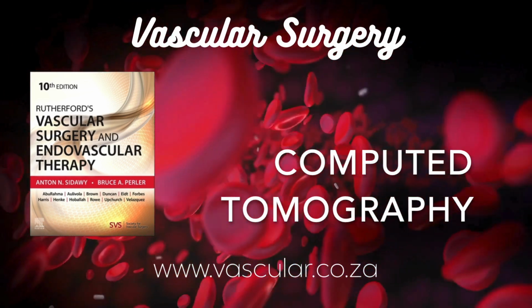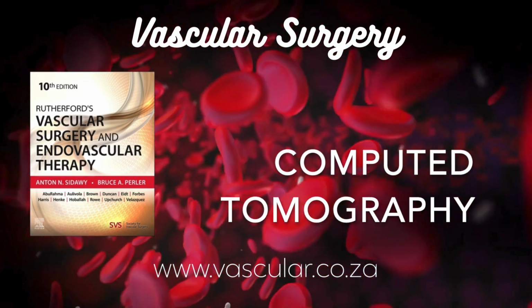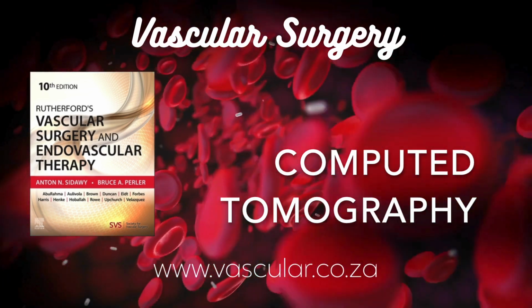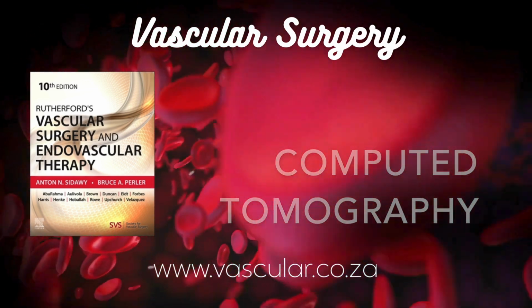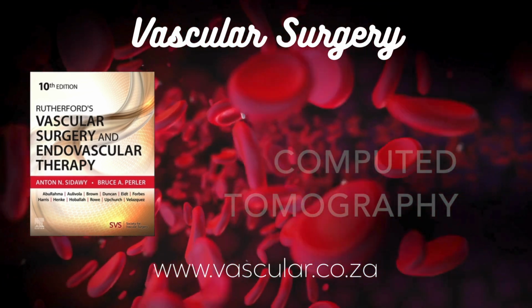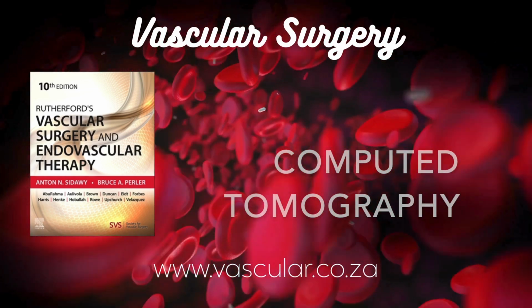MRA versus CTA. Head to head. For aortic endograft planning, CTA often wins due to better calcium visualization. For heavily calcified tibial arteries, MRA might edge it out as calcium doesn't obscure the lumen. Overall, CTA is generally faster, more available, and maybe more reproducible scan to scan. But MRA avoids radiation and iodine contrast, though gadolinium has its own issues.